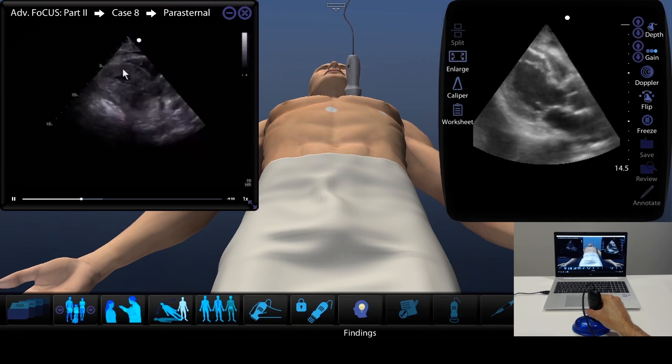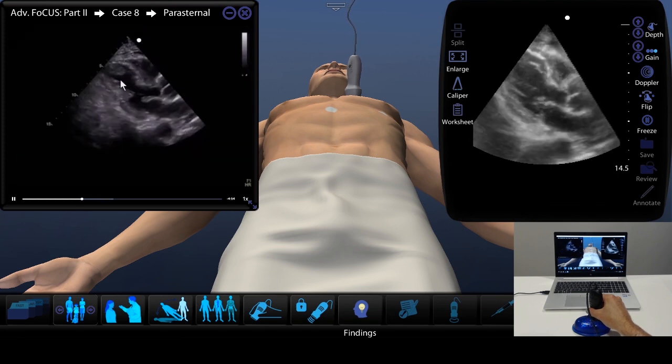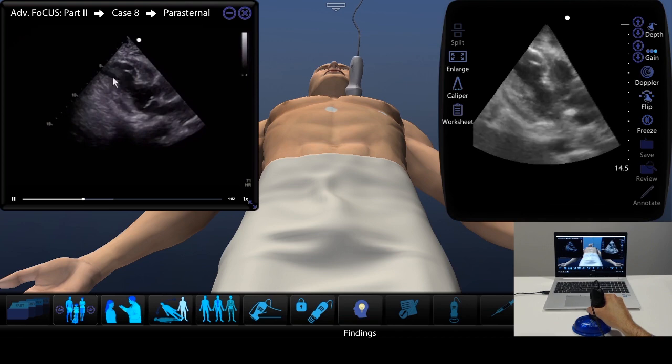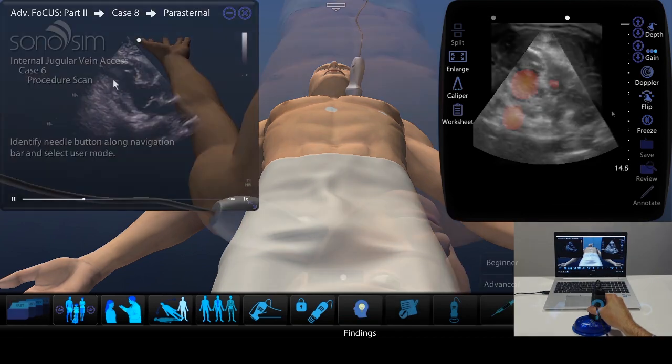The other thing we want to do is look at the apex here very carefully. There's something abnormal.